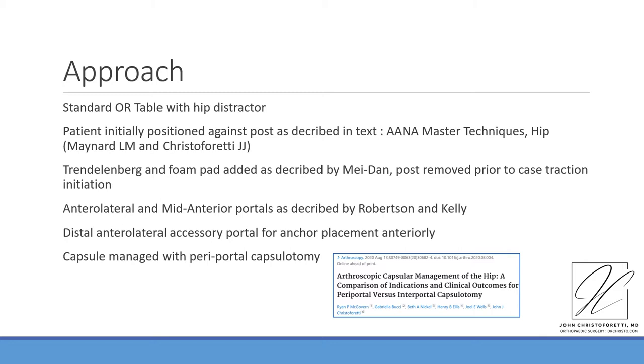We utilize anterolateral and mid-anterior portals as described by Robertson and Kelly, with an accessory distal anterolateral accessory portal for accurate targeting of knotless anchors. The capsule is managed with a periportal capsulotomy in this non-impinged case as published by McGovern et al.